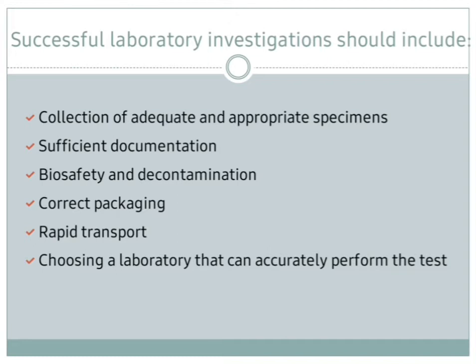Also we have to have a sufficient documentation لأنه هاي راح تساعدنا بالحصول على معلومات كاملة عن المرض. Biosafety and decontamination هاي مهمة لحماية أنفسنا وحماية المريض وحماية الانفايرمنت. Correct packaging أيضا كلش مهم حتى نضمن أنه تكون عملية الترانسبورت صحيحة وخالية من الأخطاء.